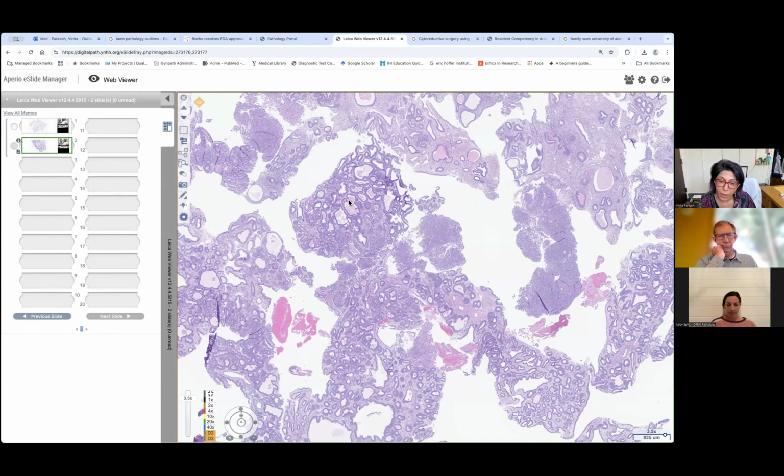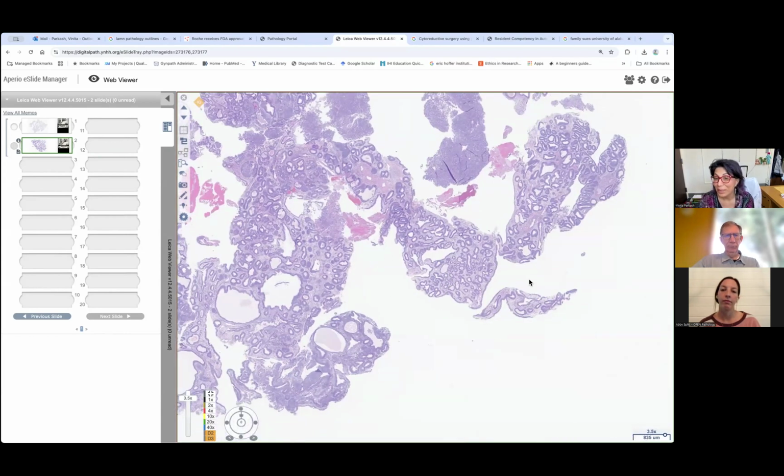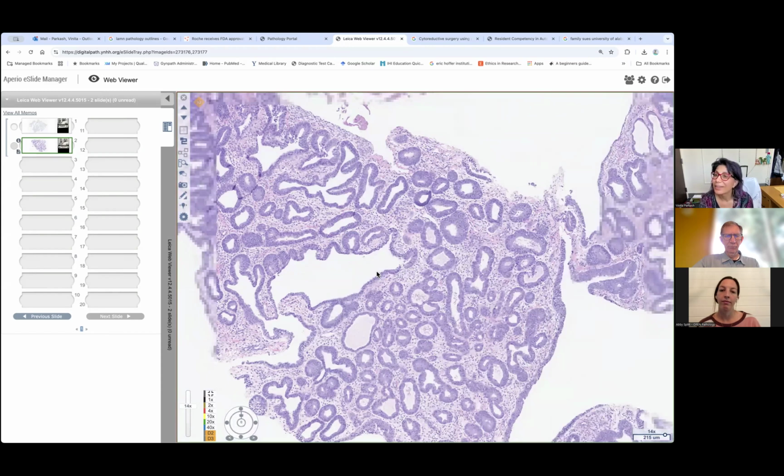We also did molecular NGS on it, and it has a bunch of other mutations, but it's copy number low and P53 mutant. So I just thought I would share it. The interesting thing to me is that all of these glands, areas that to me look like, if I didn't have any of the other stuff, this looks like atypical hyperplasia. So I just thought that this was, I've seen a few cases like this, and I've spoken to other people too, with the same sort of finding.